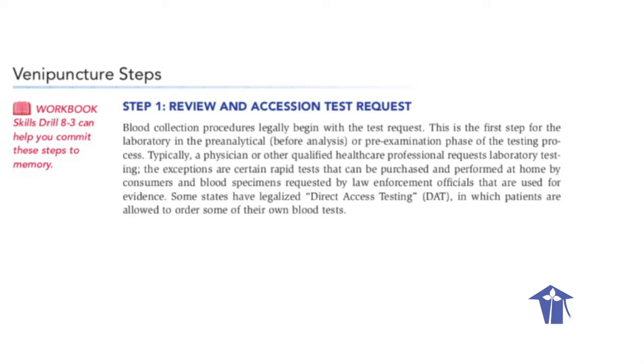Blood collection procedures legally begin with a test request. This is the first step for the laboratory in the pre-analytical, or before analysis, or pre-examination phase of the testing procedure. Typically, a physician or other qualified healthcare professional requests laboratory testing. The exceptions are certain rapid tests that can be purchased and performed at home by consumers and blood specimens requested by law enforcement officials that are used for evidence.